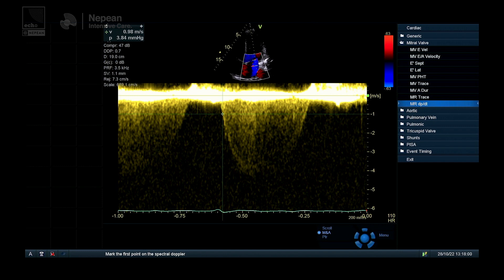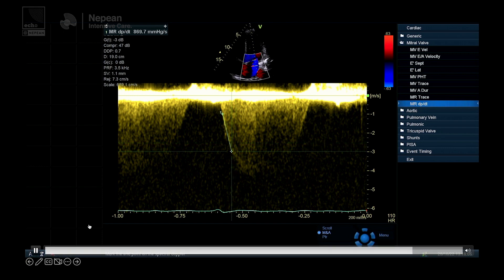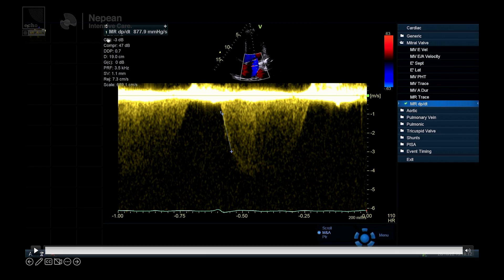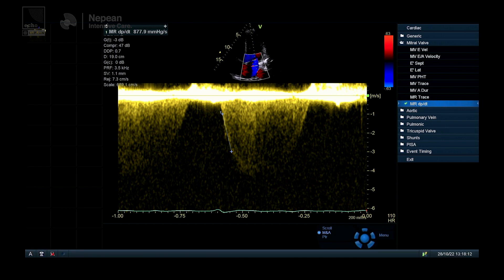Now we're taking the dP/dt measurement, placing it at 1 m/s and tracing down to 3 m/s. Using the Bernoulli equation — 4v² — we know that 4v² for 1 m/s is 4 mmHg, and for 3 m/s is 36 mmHg. Taking 4 from 36 gives 32, so if you divide 32 by the time taken for that pressure rise, you get your dP/dt value — normally in the ballpark of 800 to 1200 mmHg/s. Over 1200 is normal; under 800 is definitely abnormal, with a grey zone between the two.